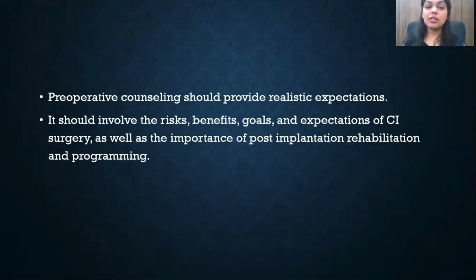One more thing which we should consider along with the candidacy is a preoperative counseling. So when we counsel a patient before the surgery regarding the cochlear implant, it should provide a realistic expectation, and the clinician should explain thoroughly about the risk, benefit, goals, and expectations of the CI surgery. Also, the user must be counseled well about the post-implant rehabilitation and the mapping procedure which is required to provide adequate benefit from a cochlear implant.